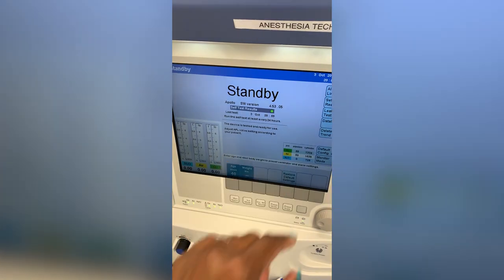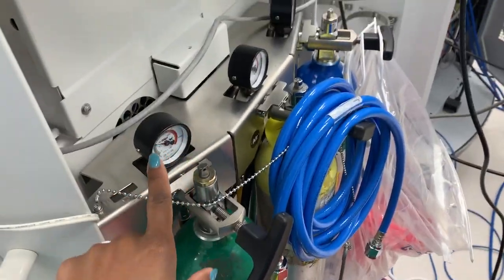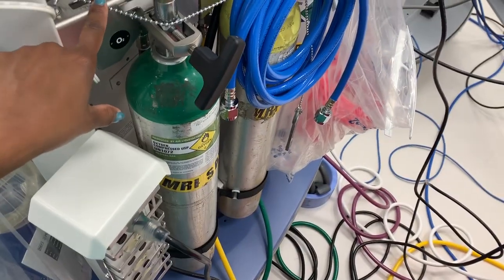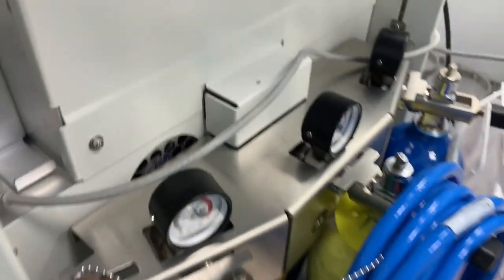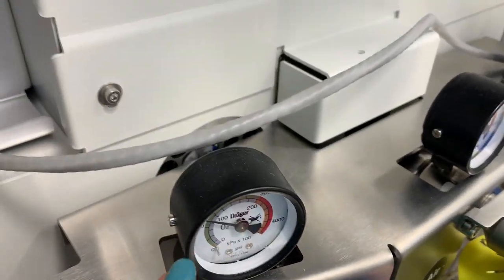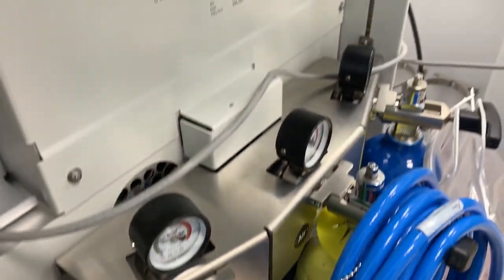Self-test was a success and the machine is ready to go. Another part of your machine check is checking at the back of your machine to make sure you have portable tanks for oxygen and that your portable tank of oxygen is full. This is a backup supply, so you want to make sure that you have it just in case the hospital oxygen has an issue or a disconnect.